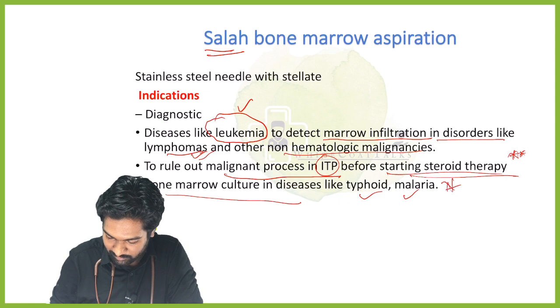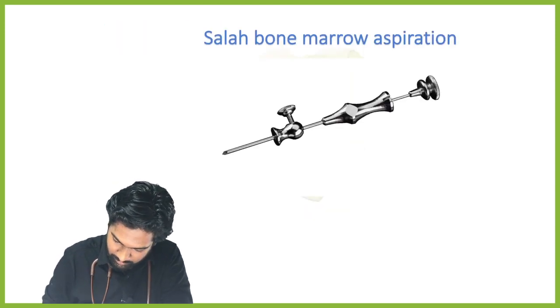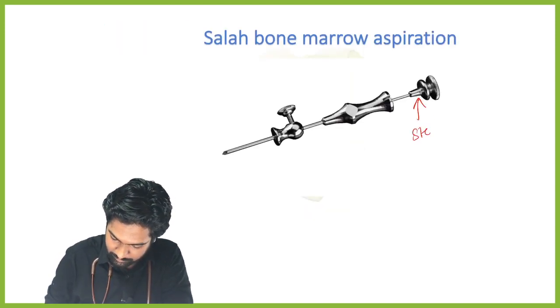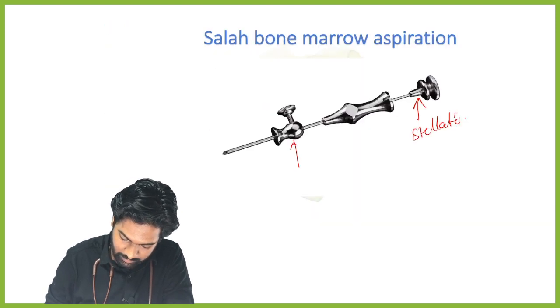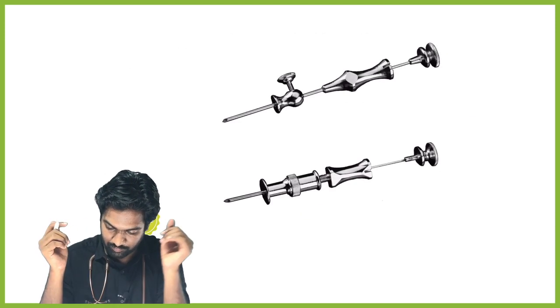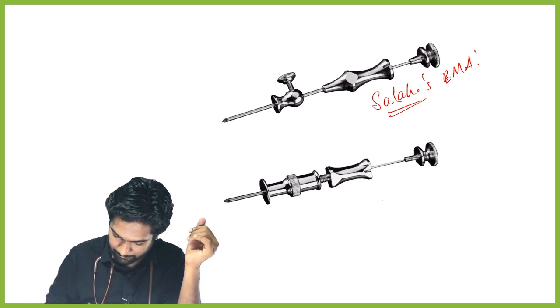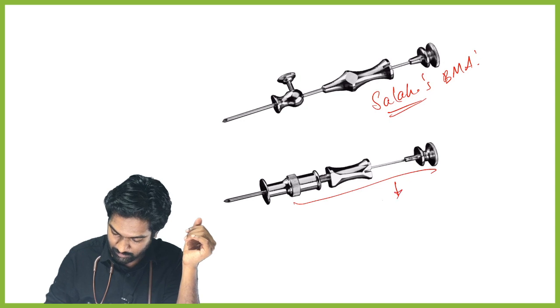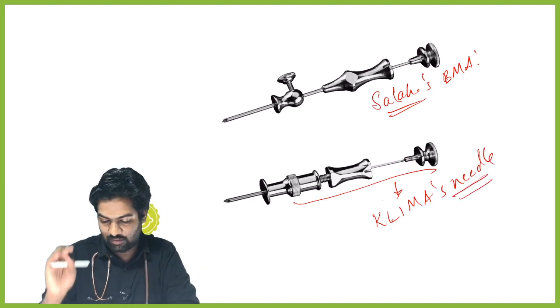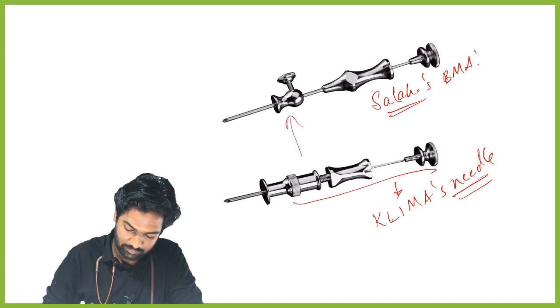You can see here, this is the stylet. This is the guard. This is Salah's. This is Klima's needle. Both are bone marrow aspiration needles only, no need to worry. Both have the guard. You can see that is the one thing common here.